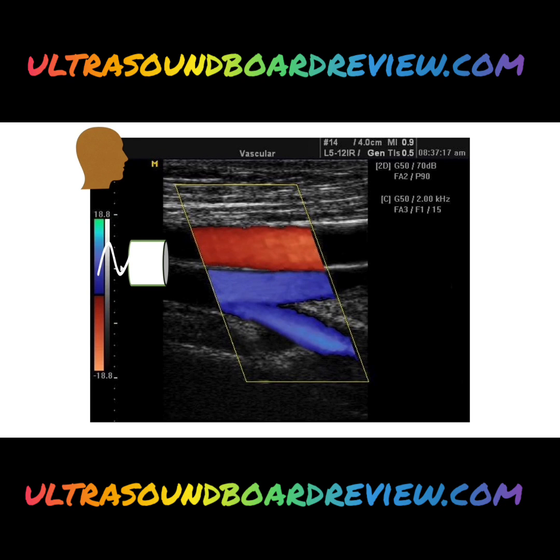We know our probe orientation is correct. Our notch is to the patient's head. All of this flow is antegrade. It's all going the way it should. We've got a femoral artery, a femoral vein, and a profunda vein.